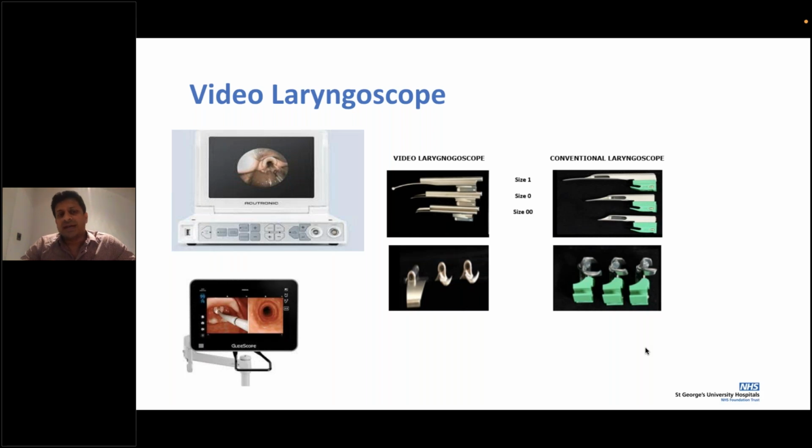Now, there has been a lot more use of video laryngoscopes, and we found at St. George's a great use for them in teaching and training, so we've actively started encouraging trainees to use the video laryngoscope. But the downside is that when you go to a unit which doesn't have a video laryngoscope, you haven't had ample practice with the traditional way of intubating and ventilating. So experience with both is absolutely essential.